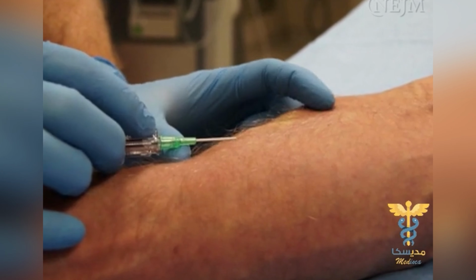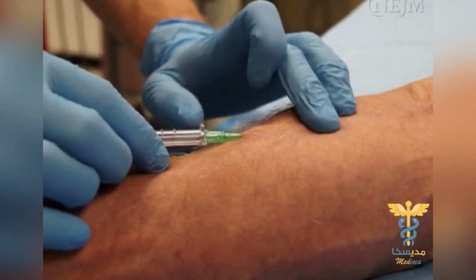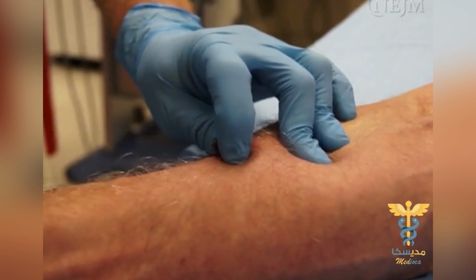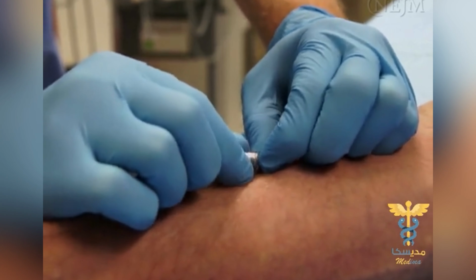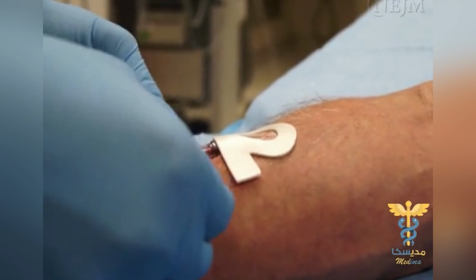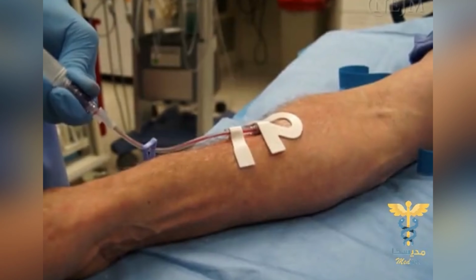While holding the needle still, slide the catheter into the vein. Apply firm pressure to the vessel proximal to the tip of the catheter. Remove the needle and place it into a sharps container. Remove the tourniquet. Place the Luer lock adapter on the end of the catheter. Anchor the catheter, adapter, and connection tubing to the skin using adhesive dressing. Flush the catheter with sterile saline.